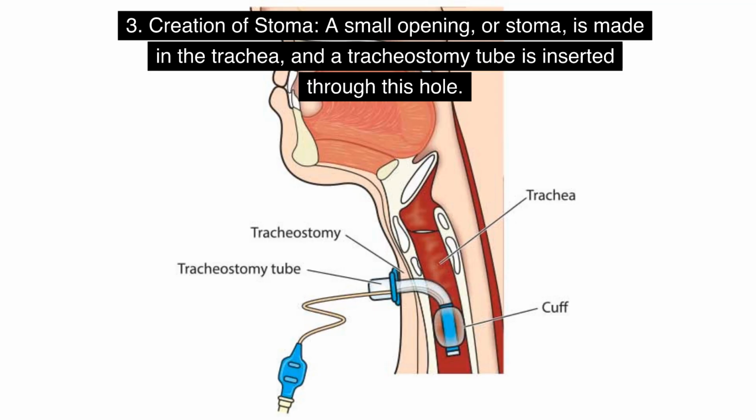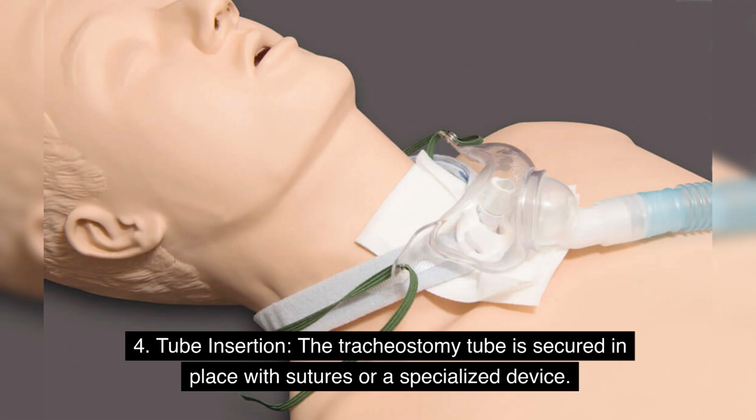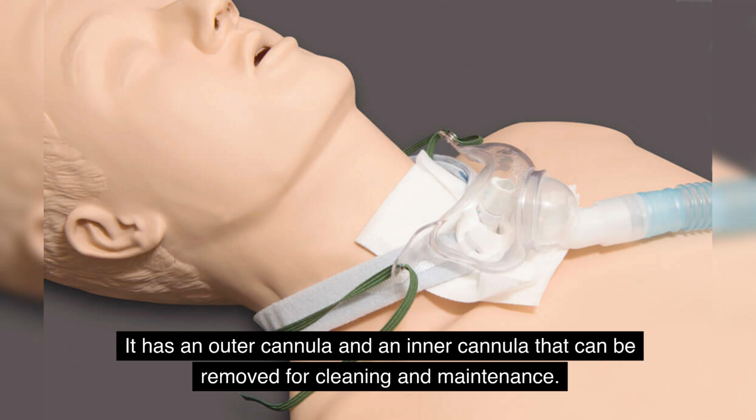3. Creation of stoma. A small opening, or stoma, is made in the trachea, and a tracheostomy tube is inserted through this hole. 4. Tube insertion. The tracheostomy tube is secured in place with sutures or a specialized device. It has an outer cannula and an inner cannula that can be removed for cleaning and maintenance.